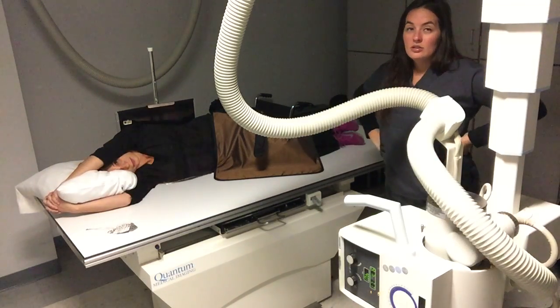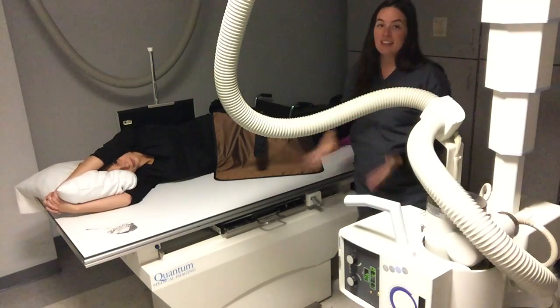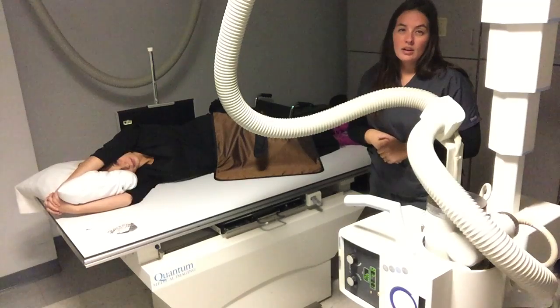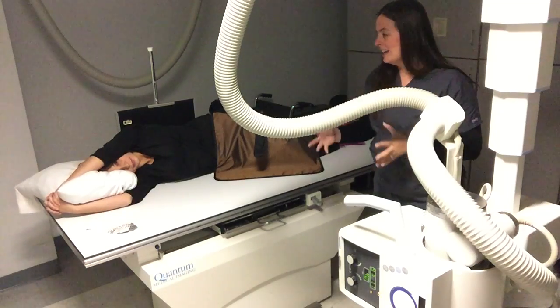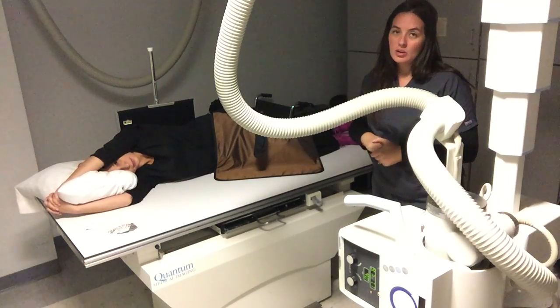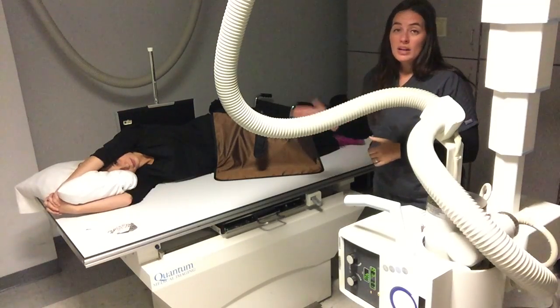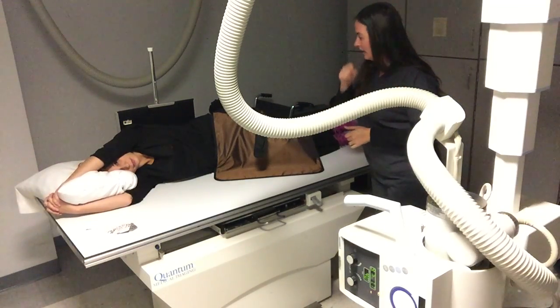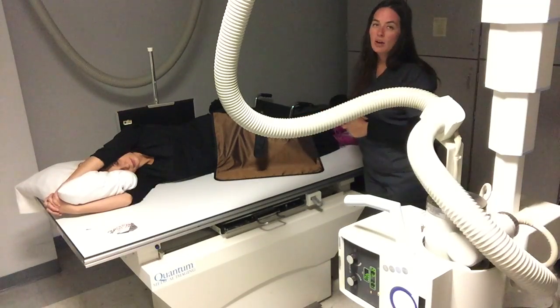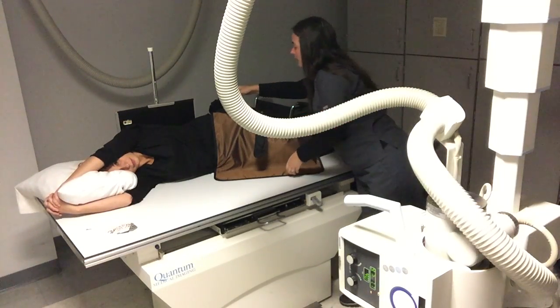Typically it takes about five minutes after you get the patient rolled up to get everything set up, so we're not going to have you waiting any longer after you've gotten this set up for your practical — just set it up and take the exposure. But in clinic, you would likely wait a few minutes to make sure everything's settling well before you expose.